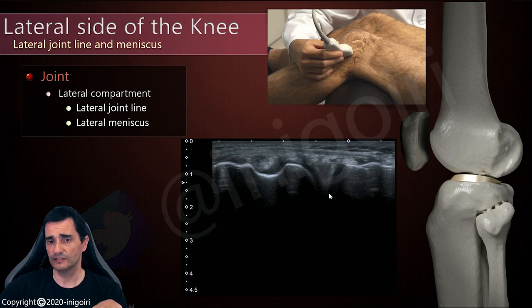As you can notice, the deep side of the meniscus is hidden, so many of the tears, the complicated ones, will not be available, not checked with this technique.